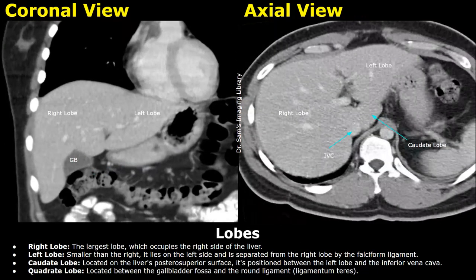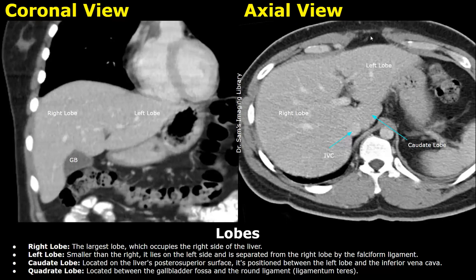Now we will look at the lobes of the liver. The largest lobe is the right lobe, which occupies the right side of the liver. This is the right lobe in the coronal plane, and here is the right lobe in the axial image. The left lobe is smaller than the right lobe. The right and left lobes are divided by the falciform ligament, which is present at this location. This is the fissure for the falciform ligament — this hypodense line divides the liver into right and left lobes and can be seen in both coronal and axial planes.